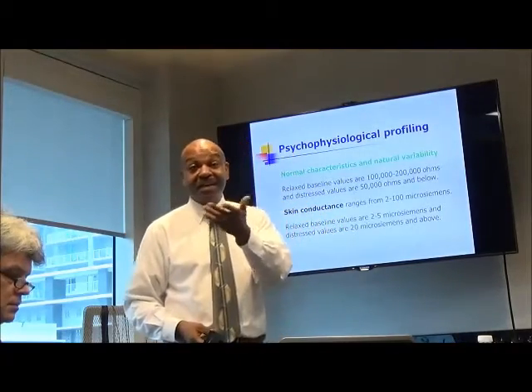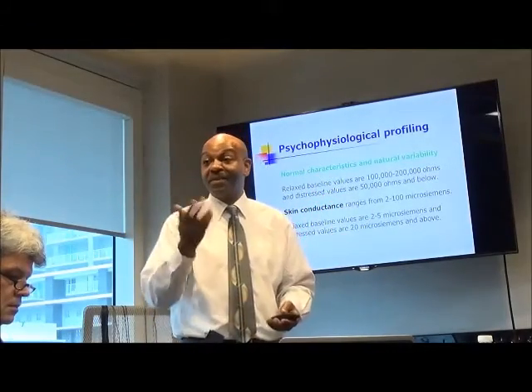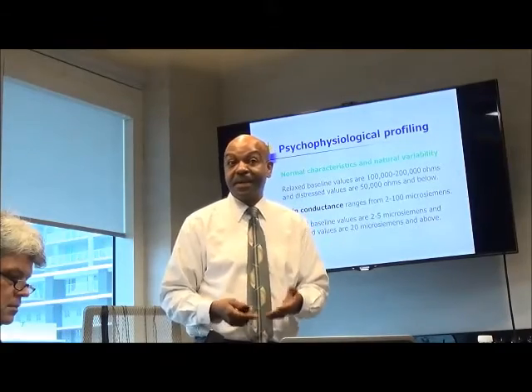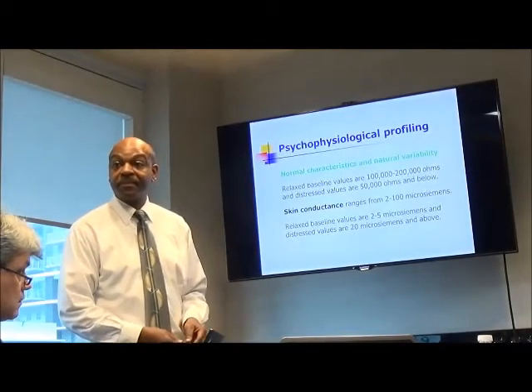So like you said, there are many times that there are things that have nothing to do directly with biofeedback that may need to be addressed. And you mentioned also some nutrition things that can be important that could be affecting what's going on. We have been using 5 as a kind of cutoff.